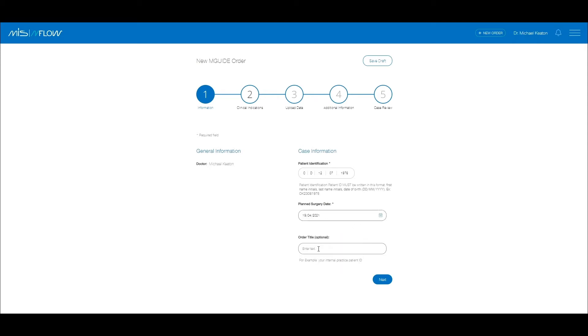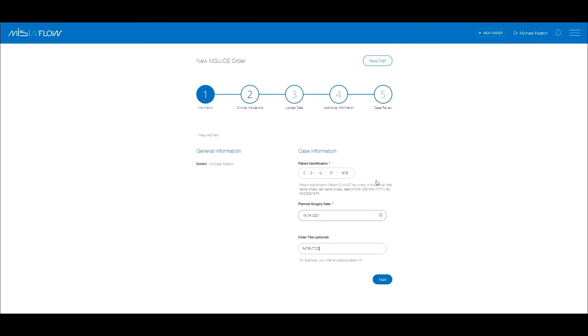In the order title box, you can write your internal practice patient code if you have one. This is not a mandatory field. At any point, you may save the order as draft if necessary. Order drafts may be reached from the home page. Click on the Next button.